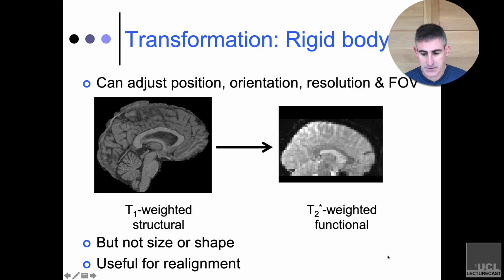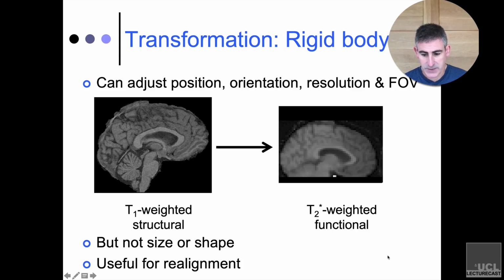Right? So what I'm doing is I'm applying a rigid body transformation of that structural, and just overlaying it on that functional. And you can see it's done a pretty good job.